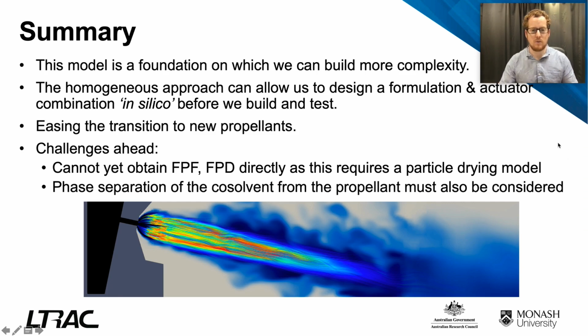So, in summary, this model that we're showing is really just a foundation that we can put more complexity on top of, and allows us to design a formulation and an actuator together in silico before we actually build and test in the lab. So potentially it's a great cost saver. Although at this point we do still need a supercomputer to run the calculations, and it takes a couple of days to run a single case. So they are rather computationally intensive.